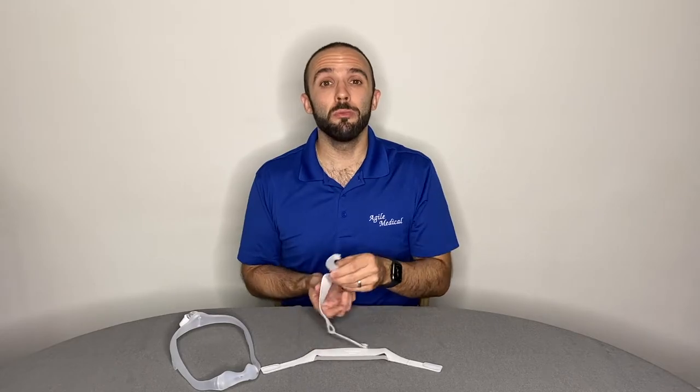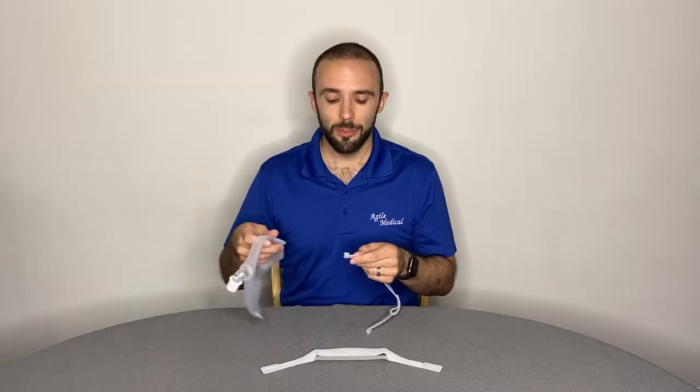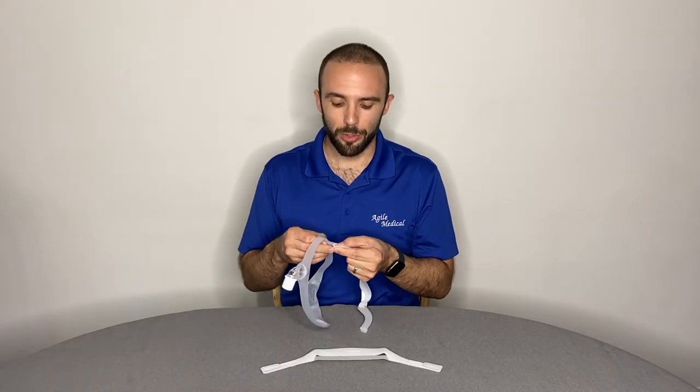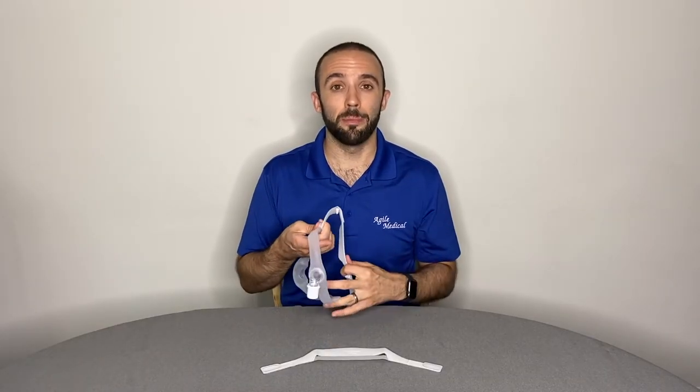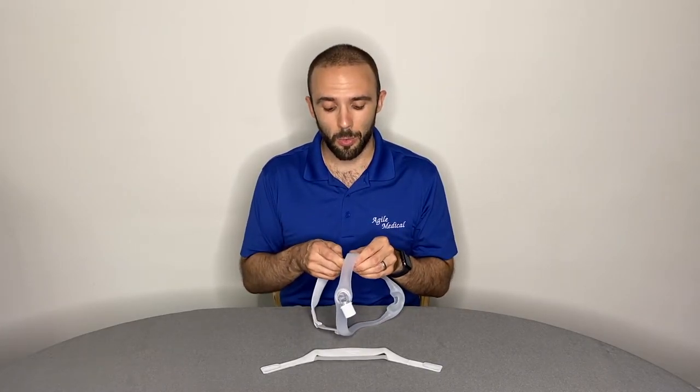For some patients, you may be using the updated nasal headgear with stability arms. If that's the case, feed one end of the stability arm through the slot on the side of the frame, again ensuring that the Philips Respironics logo is facing outward and upright.